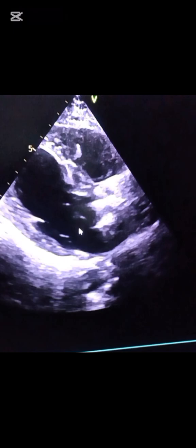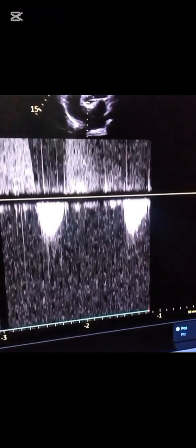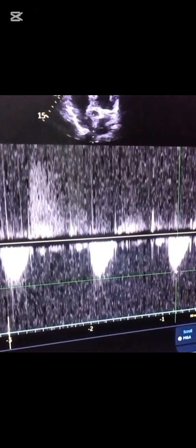For example, in anatomical evaluation, our 2D examination always gives a semi-quantitative idea of severity. For example, in aortic stenosis, the more calcified the valve, the more restricted the opening, and the more the LVH — indicating that possibly we are dealing with a severe stenosis. However, a full evaluation of the severity is by hemodynamics.